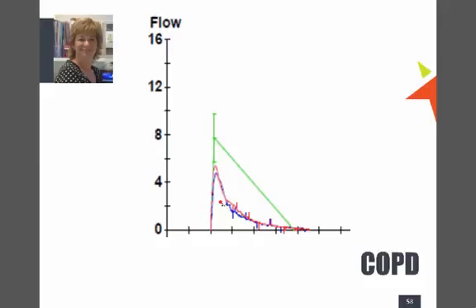What have I got here? That is a telltale of obstructive chronic obstruction. I've done another one, not much improvement here. So I haven't got much reversibility by the looks of that. So my flow's going up there, but haven't got to what's normal.